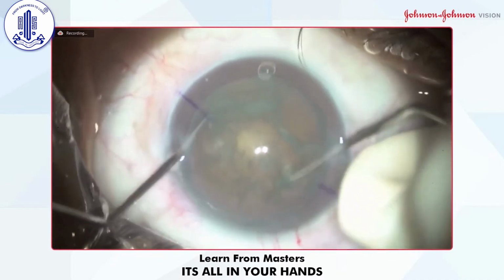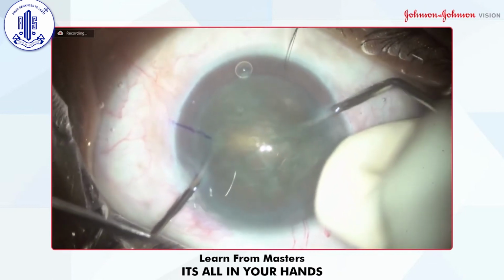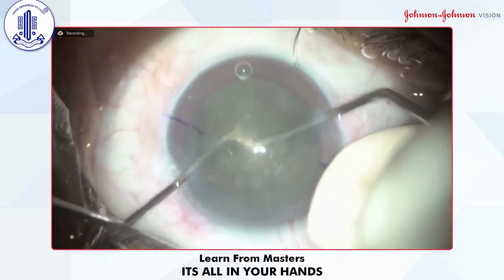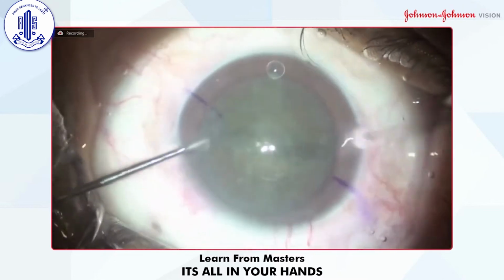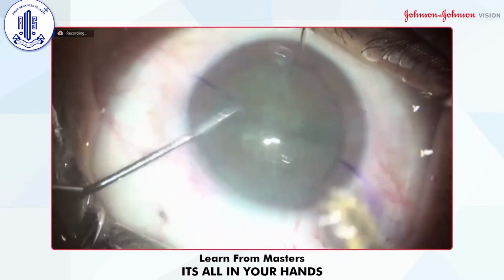You can rotate it. Sometimes I crack like this. So we can directly jump to the Phaco 2. I think, have you observed this?